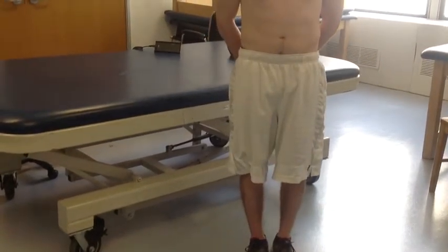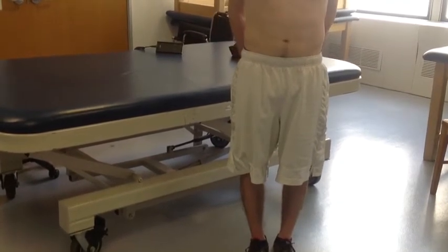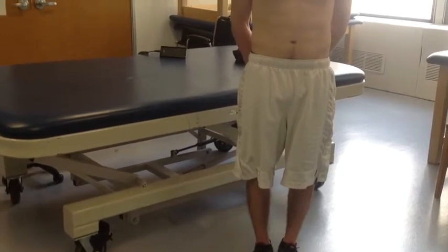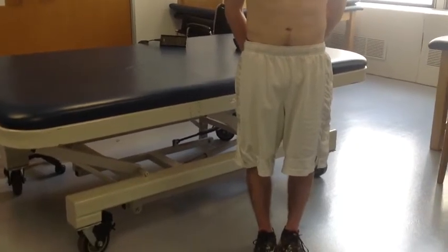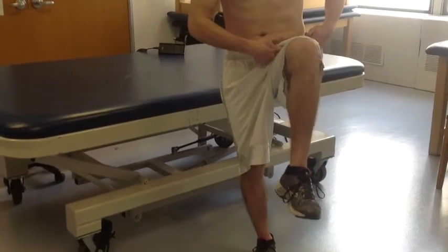As the knee nears the chest, the gluteus maximus and the hamstrings both stretch. However, if the knee is bent, the hamstrings are no longer stretched. The posterior capsule of the joint also stretches as the hip flexes. The end feel of hip flexion measurement is soft as the tissues of the anterior thigh contact the abdomen.